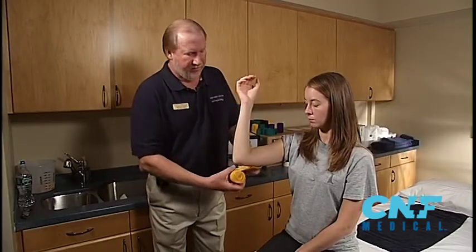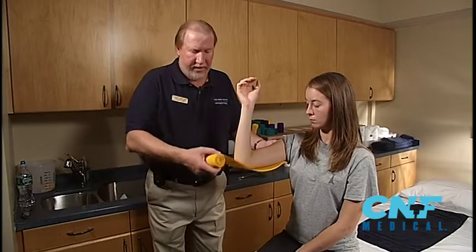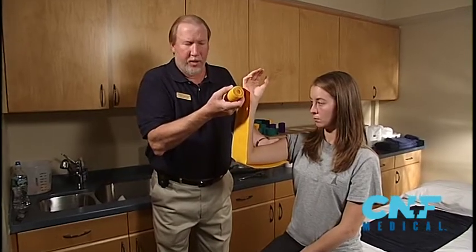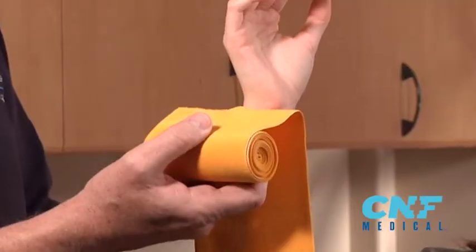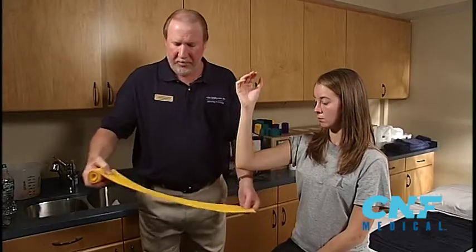My length would be three fingers distal from the axilla and right up to the fifth MCP joint. You want to support that wrist — don't start up here. You want to support that wrist right to the MCP. This is my measurement.